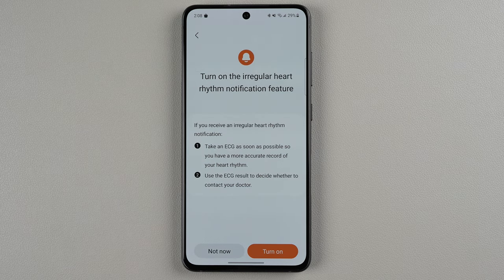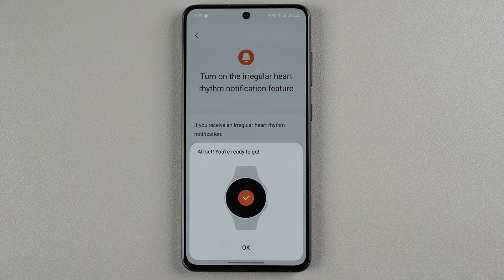Turn on the irregular heart rhythm notification feature. If you receive an irregular heart rhythm notification, take the ECG and use the ECG result to decide whether to contact your doctor. I'm going to go ahead and say turn on. If after reading all that you're no longer interested, you can say not now. I'm sure there's also a point in the settings where you can turn these off. I'll go ahead and tap turn on — all set, you're ready to go. I'll tap okay.